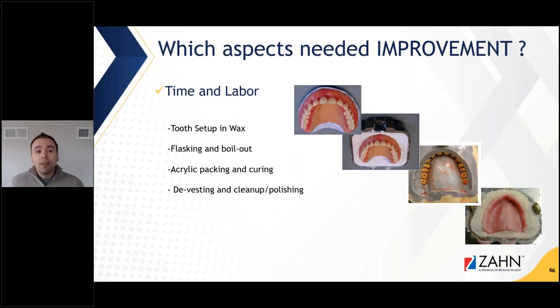So when we talk about digital dentures and the people that I spoke to that work on these materials, the main focus of creating digital dentures was to address the time and labor necessary to replace these four steps that I mentioned here. So when you think about digital dentures, you should really focus on the production side of it and not necessarily on the data acquisition, that's still the same, such as getting a model and an impression, which we're going to cover later.